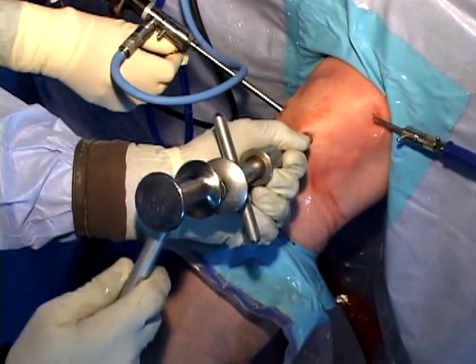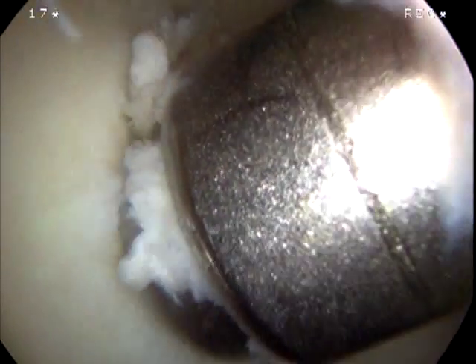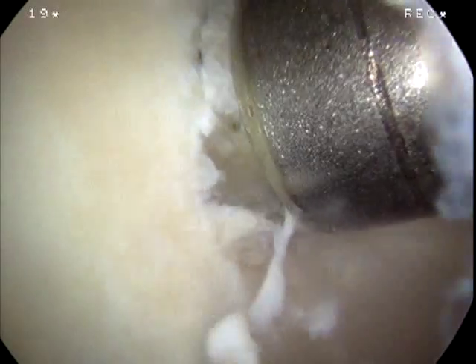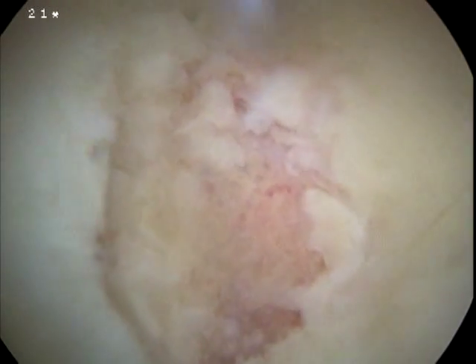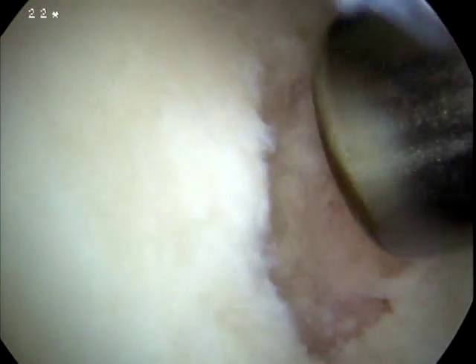No effort is made to completely fill the lesion as all of these cartilage lesions hypertrophy when treated in this fashion. A frequent question is: doesn't some of the graft fall off into the knee? Yes, some of it does; however, a loose body has not been encountered in more than 15 years of performing these paste graft procedures.